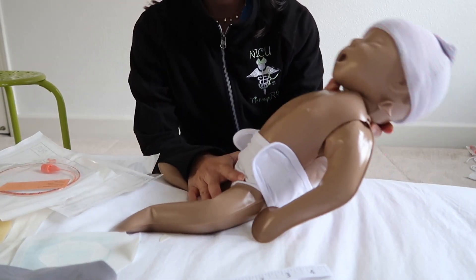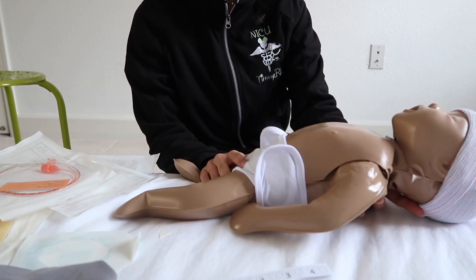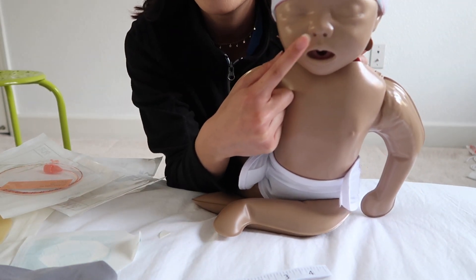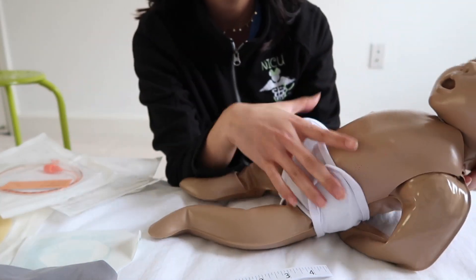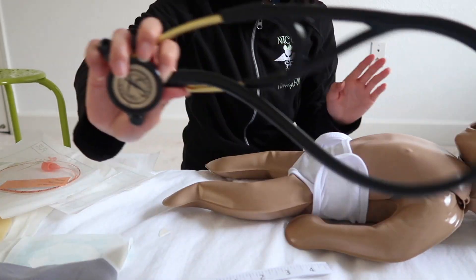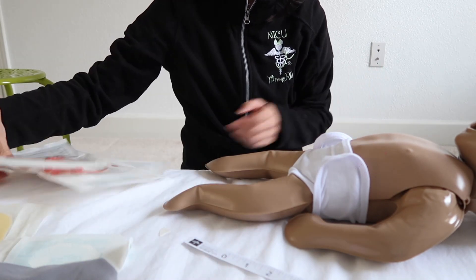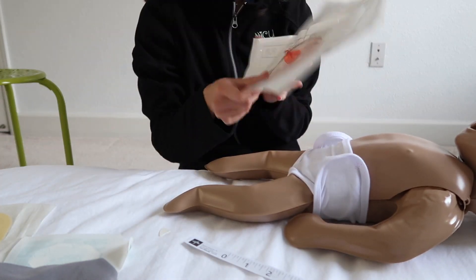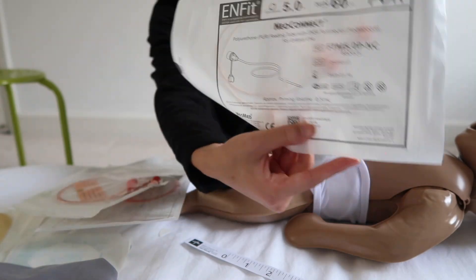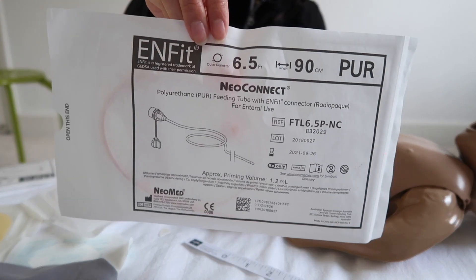Welcome back to another episode of Tiny Tips with Tiff. In this one we're going to learn how to insert an NG or OG. My baby mannequin doesn't have holes in the nares for an NG, but the process is fairly similar for an OG. First, let's go through all the supplies you'll need: your stethoscope, a paper measuring tape, and the different types of OGs which vary by size. This one is a 5 French.